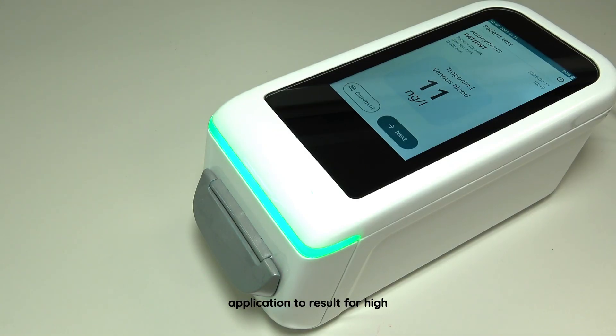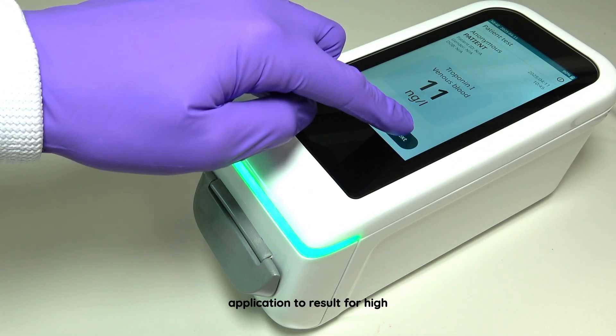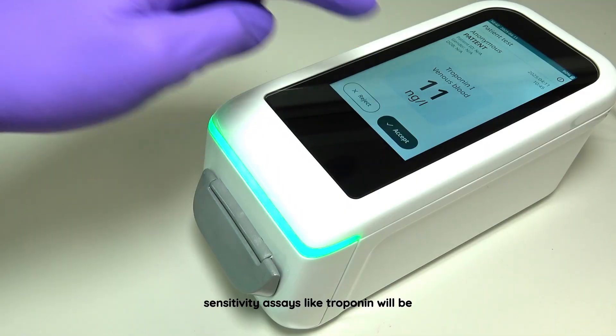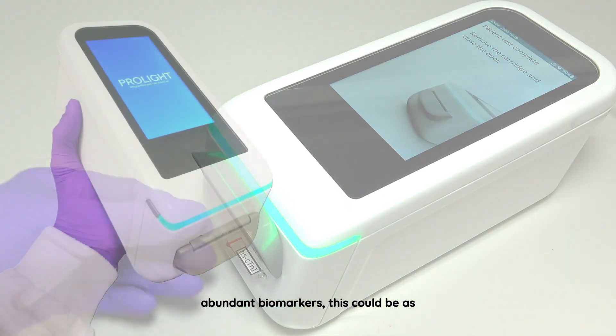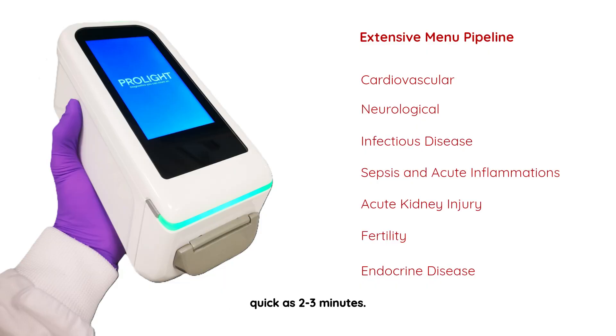The test from sample application to result for high sensitivity assays like troponin will be around 10 minutes; however, for more abundant biomarkers this could be as quick as two to three minutes. Multiple biomarkers can be measured in the same cartridge.